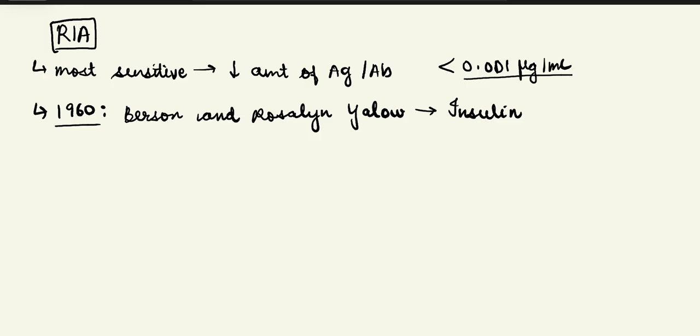Now we talk about the principle of RIA. The principle of RIA will depend upon the competitive binding. So here if I talk about the main principle behind RIA, it is the competitive binding. And competitive binding between whom?